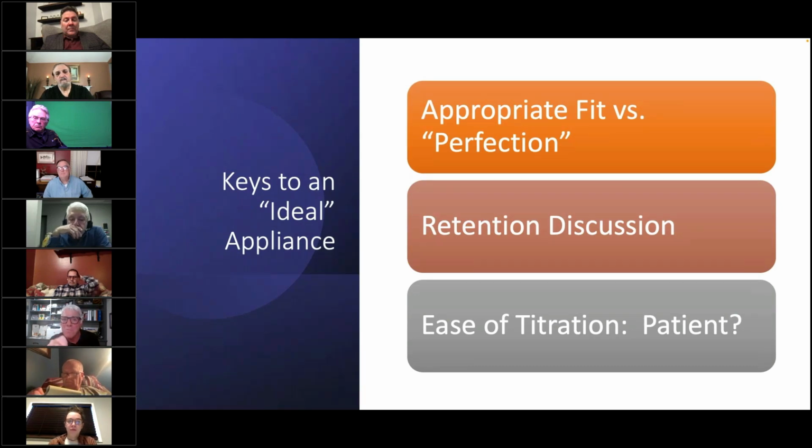We still can get minor movement. And the point is we get minor movement without appliance. So who's responsible for the movement? Big question. Not the issue. I have to say that using the appliance that I've used in all these years, tooth movement is not a problem. And with that comes the fact that we don't cover all the teeth.